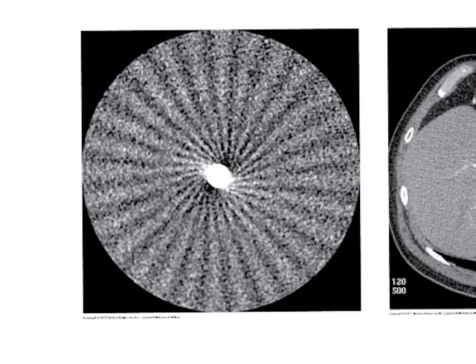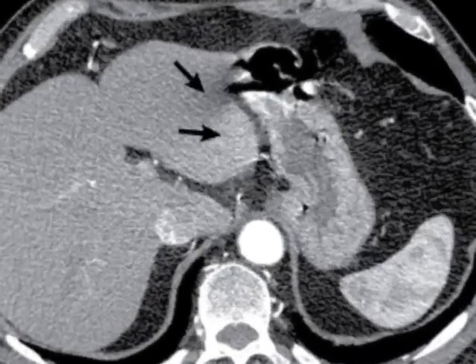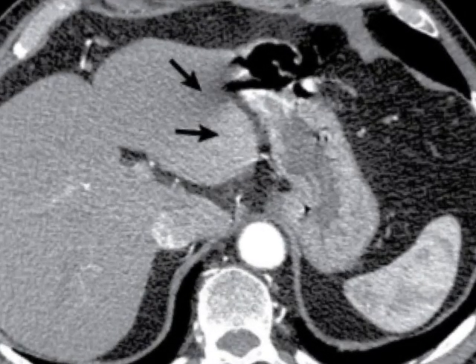This last one I'll talk about is very, very subtle. I have almost a hard time seeing it, so I'm gonna zoom in even more. Fortunately, we've got these arrows here. It's called an edge gradient. And what's happened here, very interestingly, is we have air.